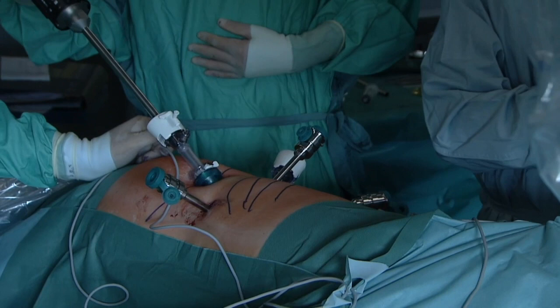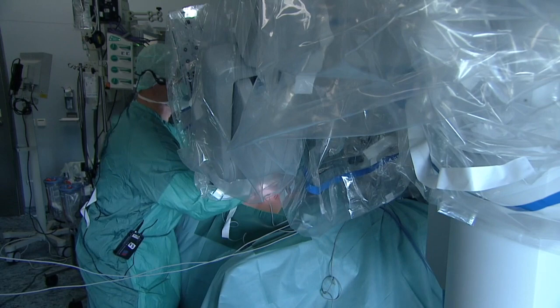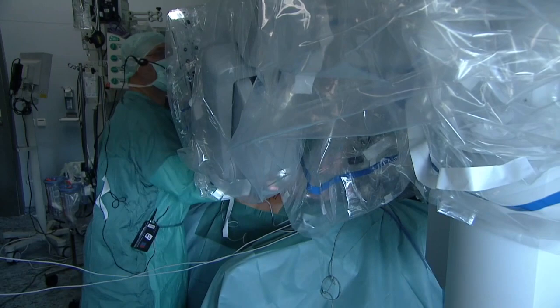So come on and bring the robot in. I do all of the tumors posterior and lateral retroperitoneally, and then the anterior tumors I do transperitoneally, okay?